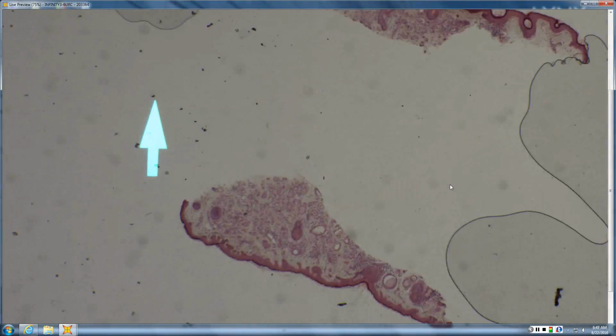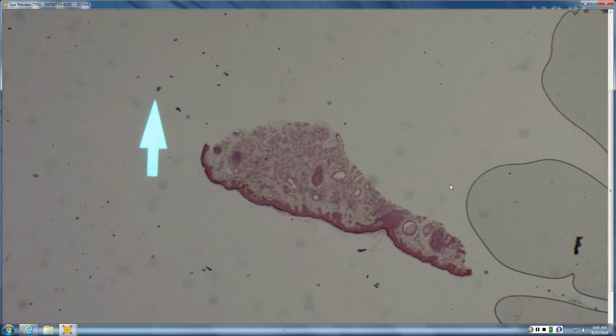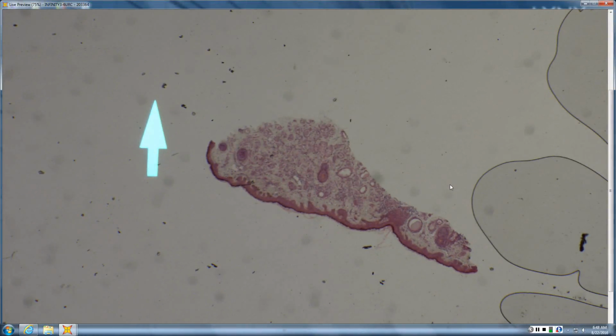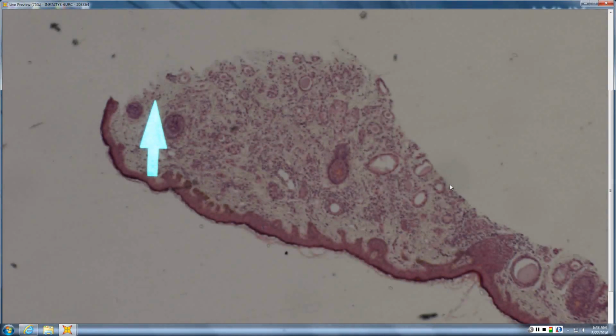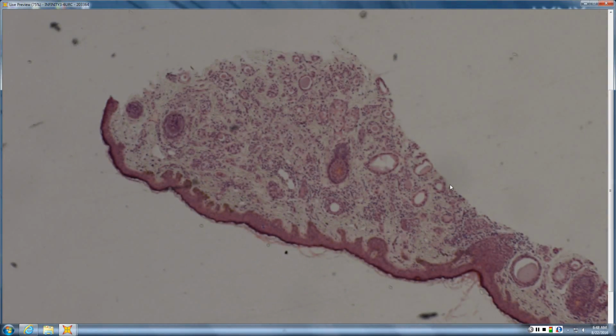Okay, so this second one is a clear cell syringoma. And later when I get to syringomas or some of the other Paisley-Tie differential, I'll go through, like we did with the pilar trichoepithelioma chapter, some ways to differentiate them. But in short, this is a very small, well-circumscribed proliferation of what looks to be little sweat glands. Now, because it's clear cell, from scan, it just looks like a bunch of cells, or almost like a bunch of infiltrate. It's hard to tell that they're actual ducts. I mean, obviously there's some big ones here, but it can be hard to distinguish.